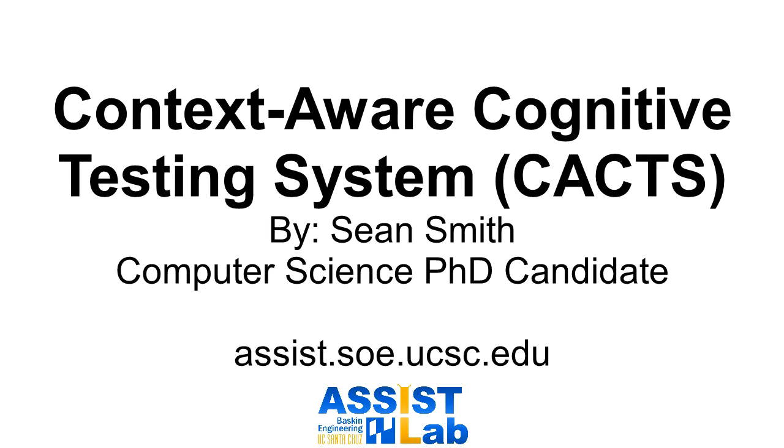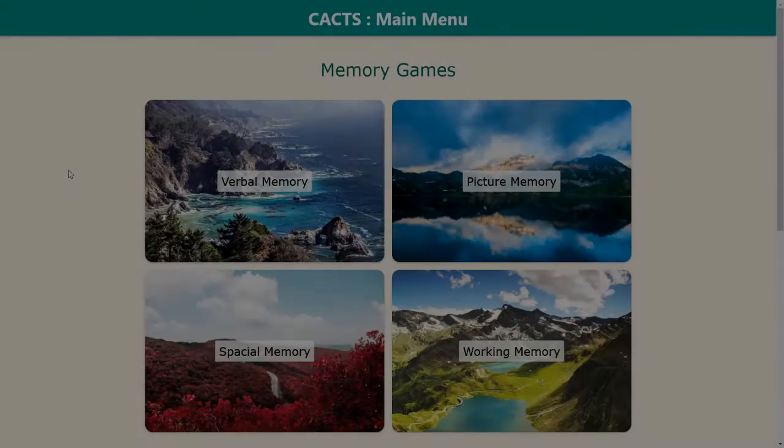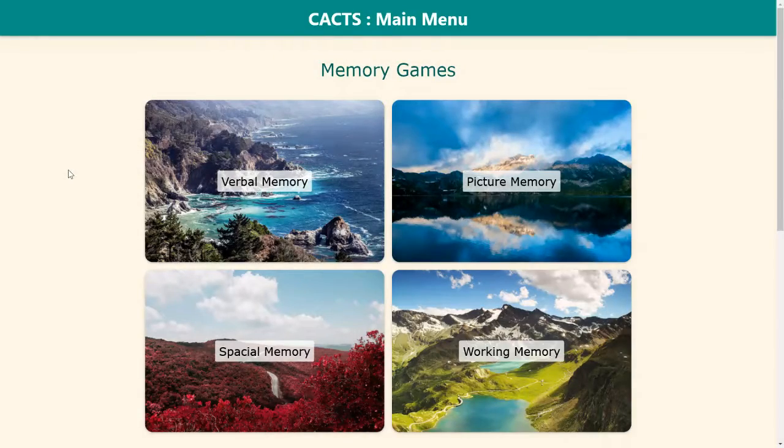Hi, this video will present a brief overview of our proposed context-aware cognitive testing system, or CACTS for short, for older adults and caregivers. This project is conducted by the ASSIST Lab at UC Santa Cruz under the guidance of Dr. Sri Kurniawan.